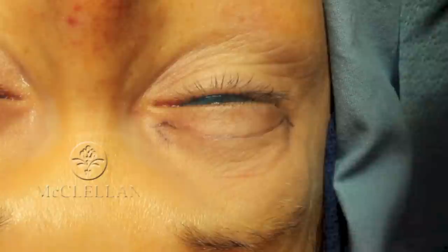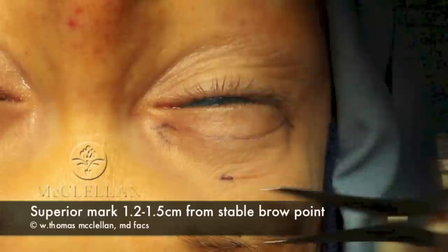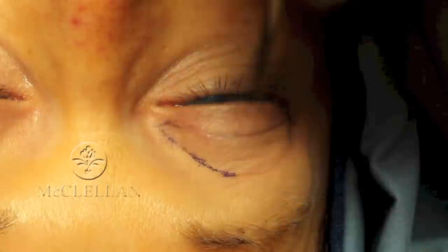Then I create a standardized mark in the brow that I base my measurement off of, and generally that's 1.2 to 1.5 centimeters, and that is the upper edge of my incision. Then I'll connect the medial incision to the lateral in a curved linear approach which matches the inferior incision.